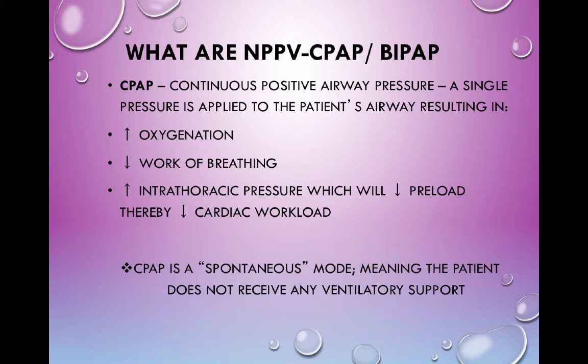So when we're talking about CPAP BiPAP, if you've seen patients, usually it's a machine on a stand, it's a hose, and it's a mask of some sort. This is not an endotracheal tube or a tracheostomy tube, although there are cases where you can do that, but we're talking specifically about masks. So CPAP, there's a lot of different types of patients.